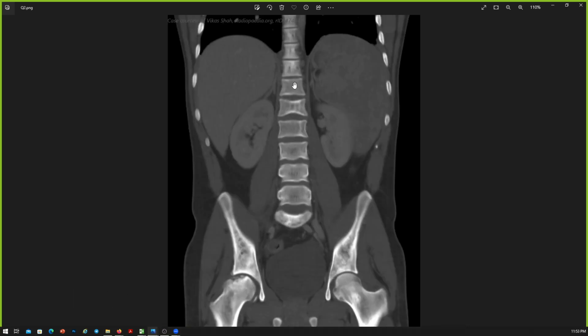And then this case, again, yeah, this is a very important case. You identified all the positive findings. You saw the H-shaped vertebra. You saw the diffuse skeletal sclerosis. You found the avascular necrosis of the right femoral head, as well as, after prompting, you did identify the enlarged spleen. But you were correct in doubting that this could be the stomach. So that is good enough, and this is a case of sickle cell anemia.